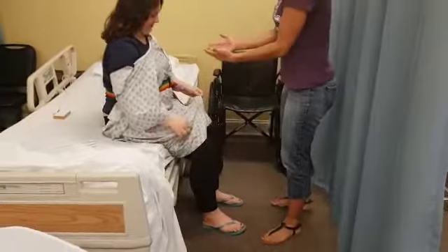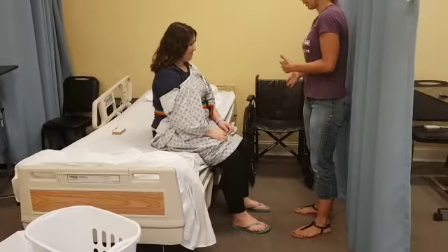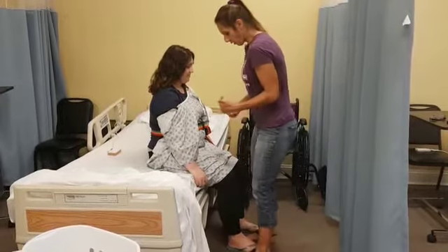All right, so what we're going to do on the count of three: we're going to stand up, and we're going to turn, and we're going to sit in the wheelchair, okay? We have to give them direction of what we're going to do in our count of three. I need to brace her lower extremities.